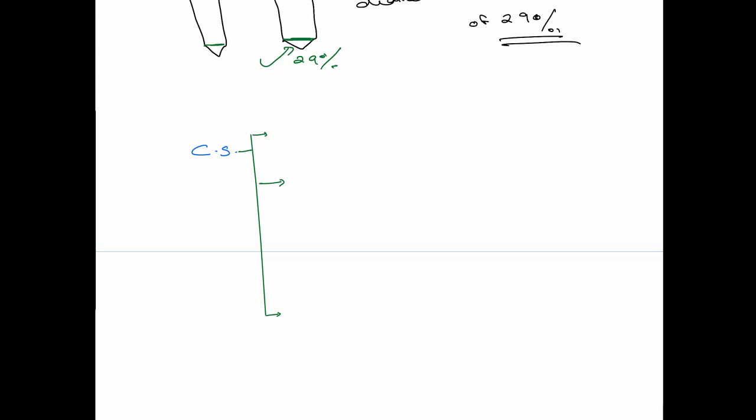Now coming on to the cross section part. Again, it's the same cross section like the one we saw in the light speed. It is triple U shaped cross section with radial lines, same like the previous one. There was no difference to be noticed here.